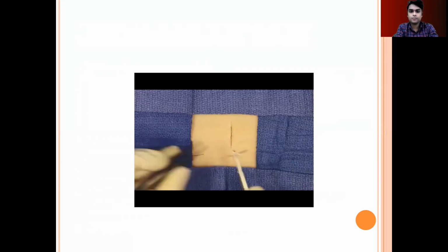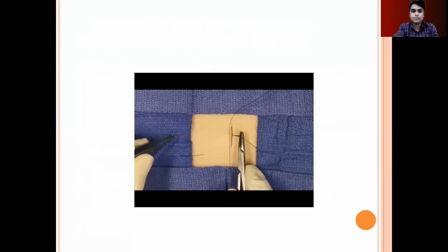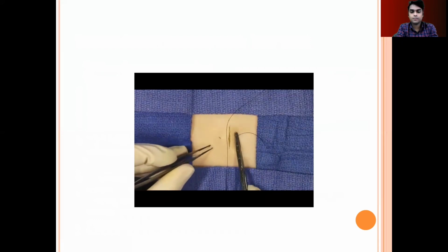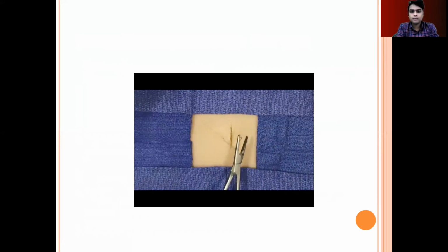Interrupted suture. It starts at 90 degrees, moves somewhat outwards as it follows the curvature of the needle, and exits on the contralateral side of the wound in a similar fashion. It is pulled through gently and gently tied. Suture material is tied.